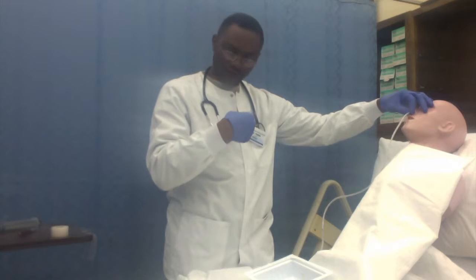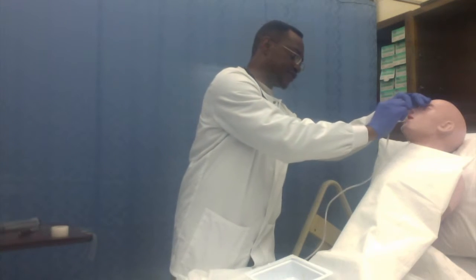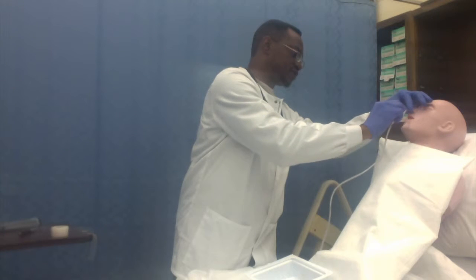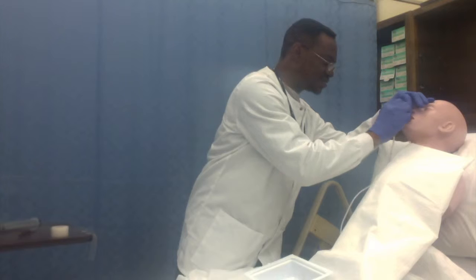I might also have the patient drink some water, and when he is swallowing the water, that will facilitate the insertion process. So I insert my tube 1 inch at a time to when I get to the point that I marked before.